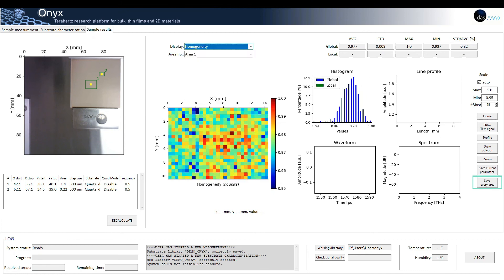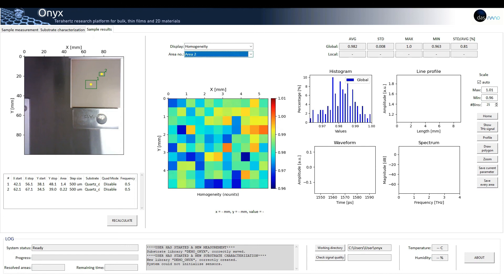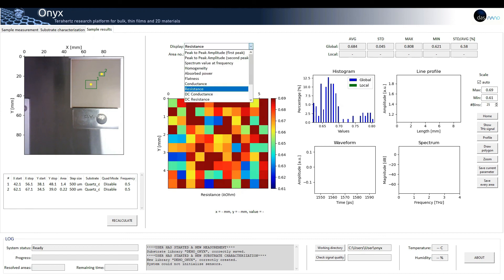The save every area button allows to save all the maps generated from the current inspection, as well as all the raw data, in case the user wants to do additional post-processing.